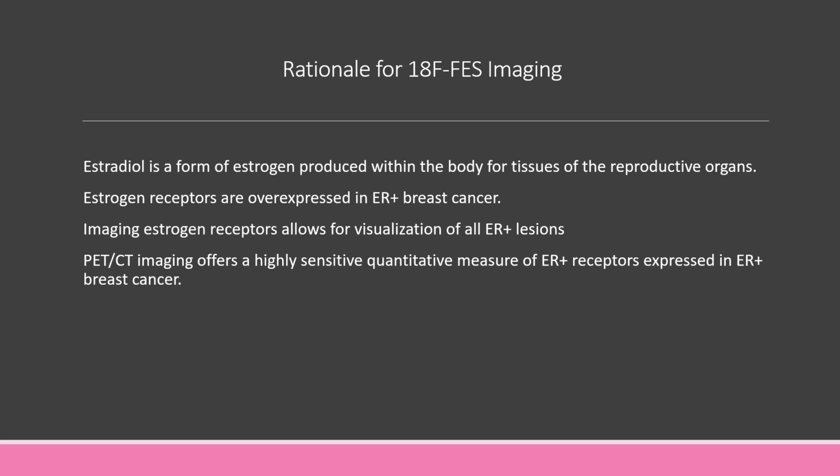So that brings us to the rationale for F18 FES imaging. This is estradiol, which is a form of estrogen produced within the body for tissues of the reproductive organs. And estrogen receptors are overexpressed in patients with ER positive breast cancer. So imaging the estrogen receptors allows for visualization of all ER positive lesions. PET-CT imaging offers a highly sensitive quantitative measure of ER positive receptors expressed in ER positive breast cancer.